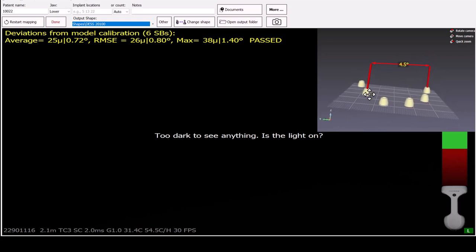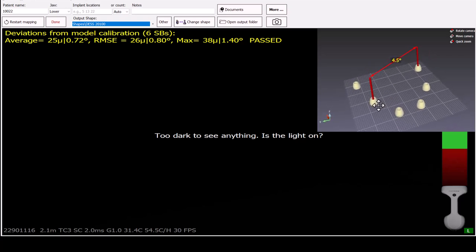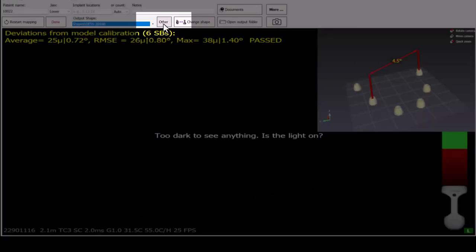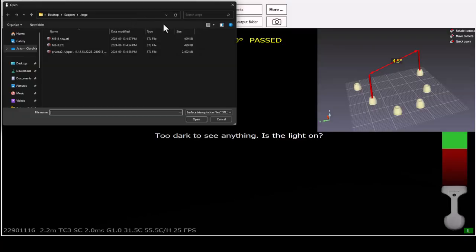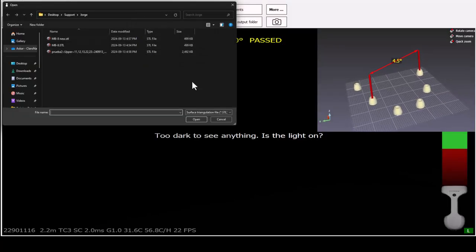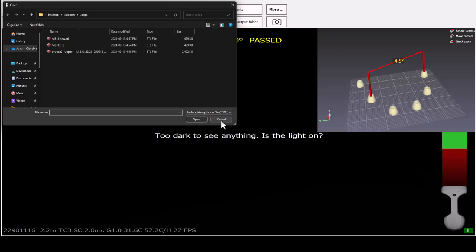However, if you wish to add your own scan flag, you can do so by pressing Other and selecting the desired STL file for import from your computer.